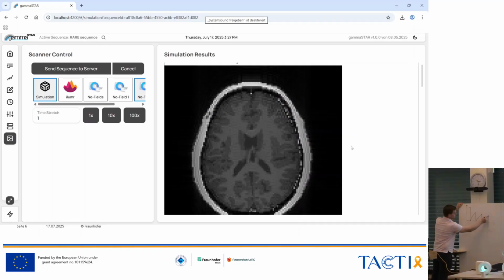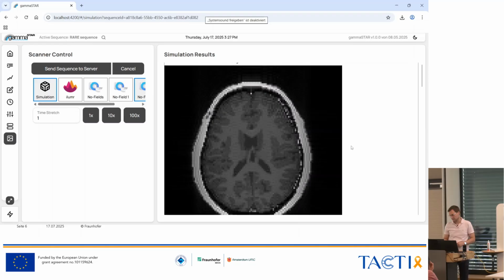And at some point, the process of relaxation is exactly the same for each repeated measurement. So the first, second, probably also the third segment that we acquire just introduces artifacts because not being in steady state. But with the second measurement, we already, for the first measurement, are in this steady state scenario. So we start in steady state and get a clean image.